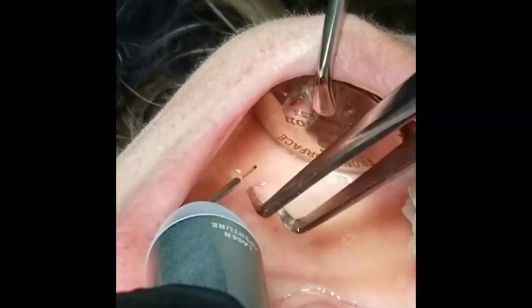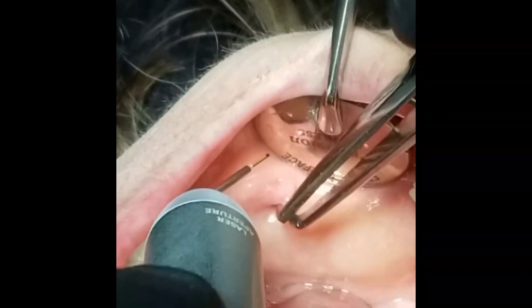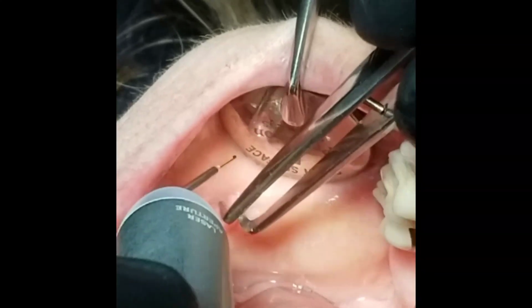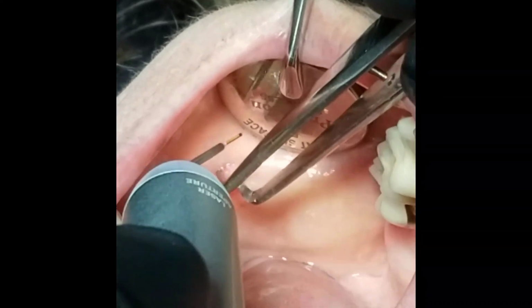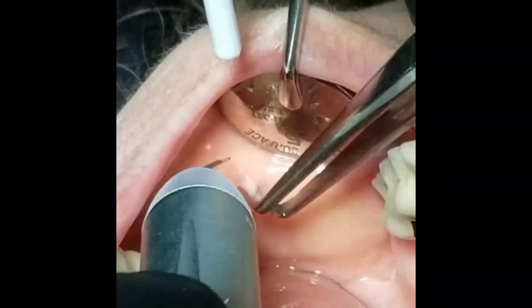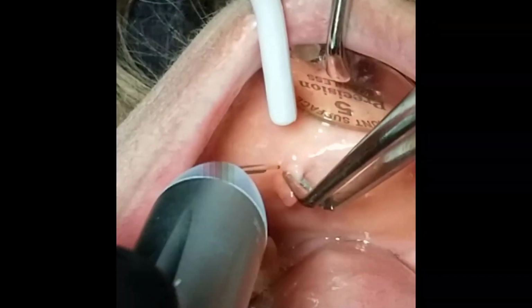Open really big. Again, the patient has one drop of septocaine on either side of the fibroma. When I say a drop, I mean a drop, not a carpule, because you're going to distort the area and make it tougher for you to work.